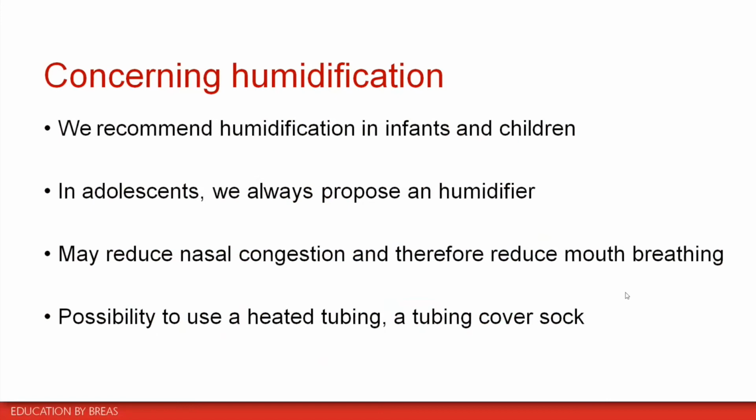For the older children, it's easy because you can ask them if the mouth is dry or not, if they need to drink during the morning, if they have some difficulty to tolerate the air that is too cold. And once again, you have to adapt humidification according to this information.